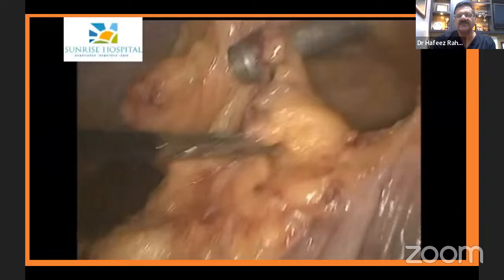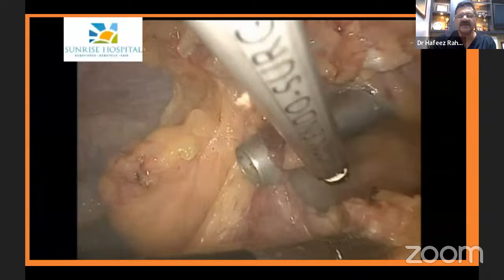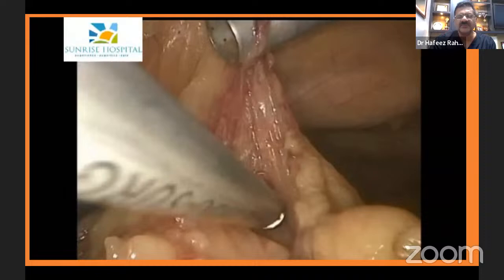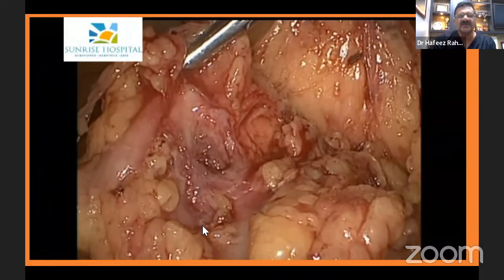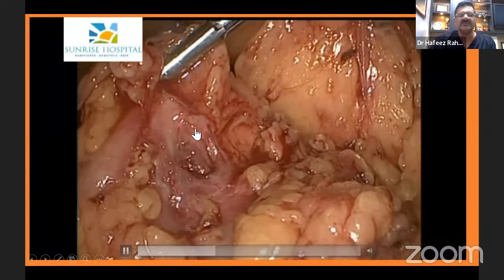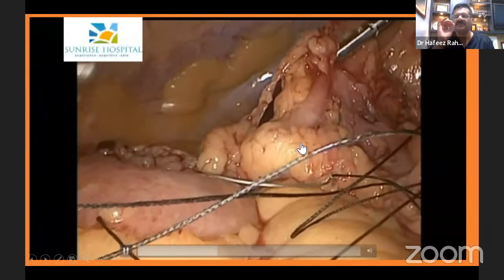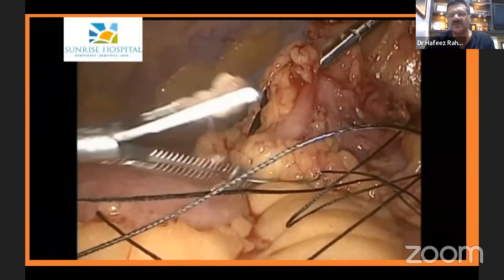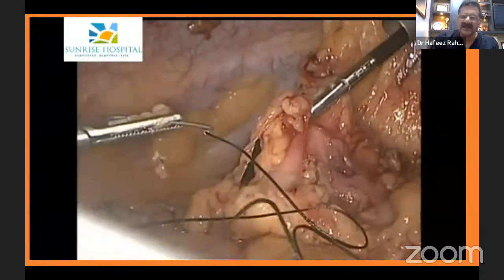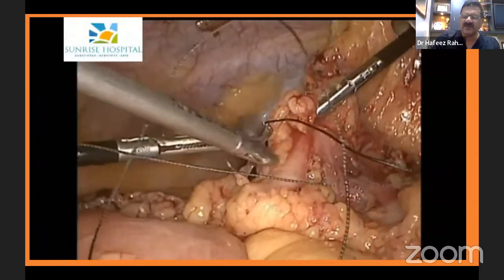Can you see that here? You can see where the trocar has gone, and exactly in that area, you will find that there is a small injury of the bowel. See, these kinds of injuries, unless you search exactly that area, this is the bowel injury here, can be very, very easily missed unless you look exactly at that area. So this is identifiable only because we didn't remove the trocar immediately. The usual instinct is that you just remove the trocar immediately, and that is where most of us get into problems identifying the bowel injury.